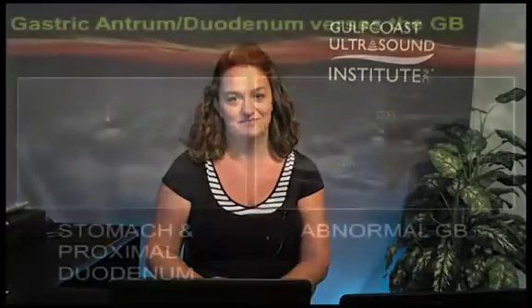Hi, I'm Teresa Jorgensen, and today's Gulf Coast Hot Tip will demonstrate how to tell the difference between a gallbladder full of stones and the nearby GI structures, the rolling stone sign.